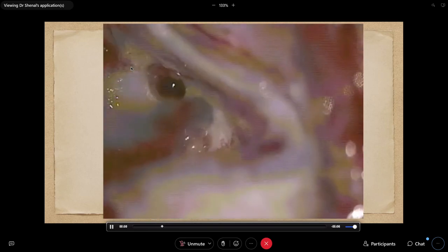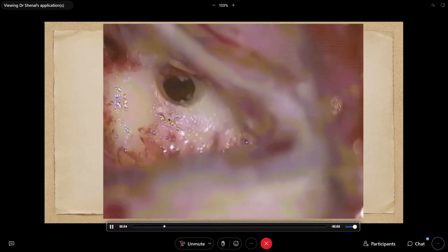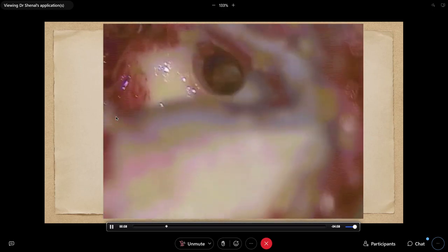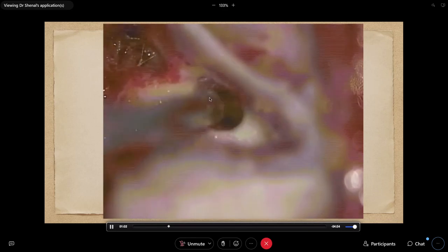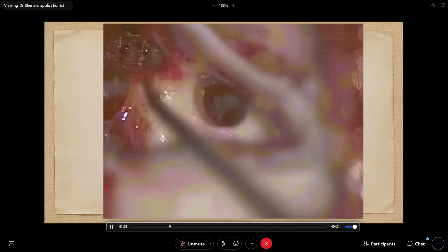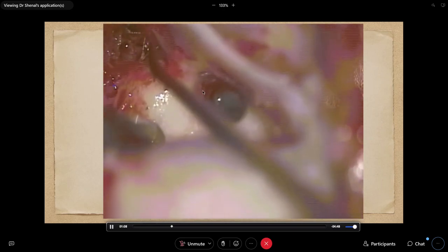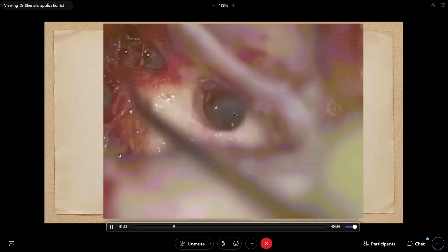And we know that the round window cannot be more than 2 millimeters away, or 2 millimeters posterior inferior to the stapes. So let us see now. You can very well see the pink of the facial now. And see, this is our stapedius, the pyramid. And here is your IS joint. We'll just palpate the incus from this side, and we'll see this moves. So we know that this is our IS joint, and here is your round window.